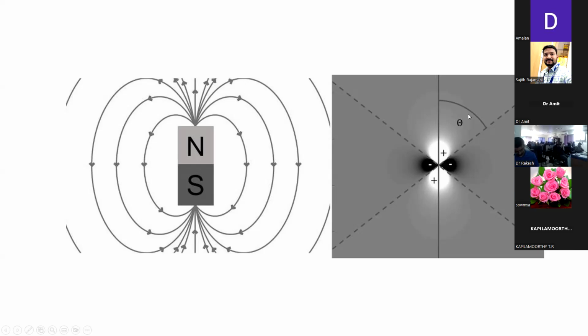It is 54.7 degrees. We are all very familiar with the magic angle, which always creates T2 prolongation, especially when we do musculoskeletal imaging, where it appears bright in T2 with the PD weighted image, if we use less than 30, 35 millisecond TEs. So the value we need to concentrate on here is that the value along the magic angle is actually 0.